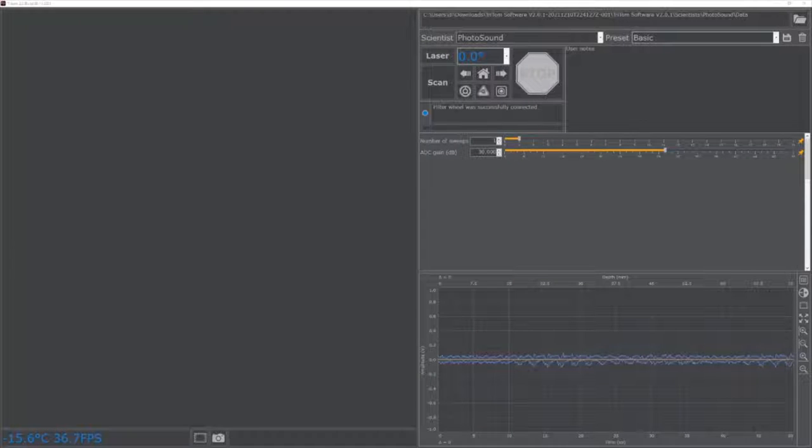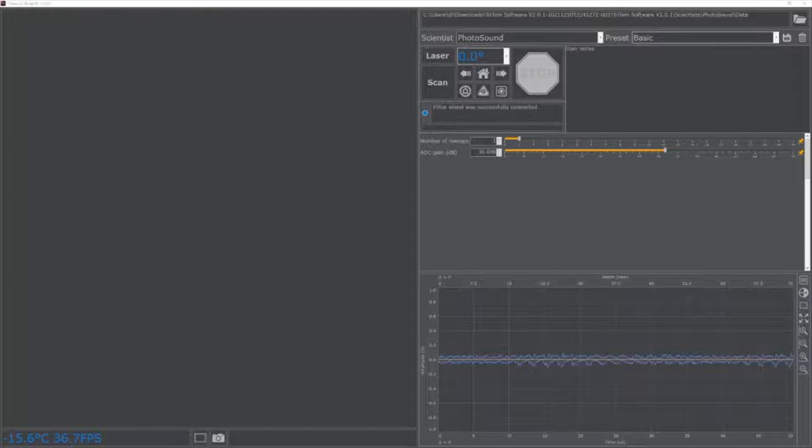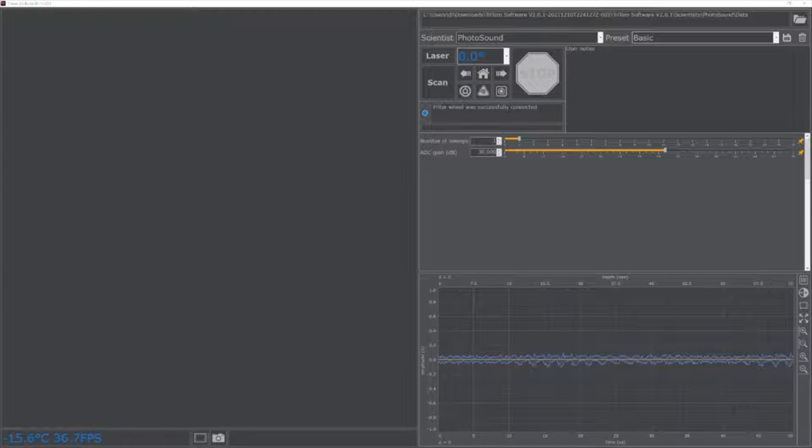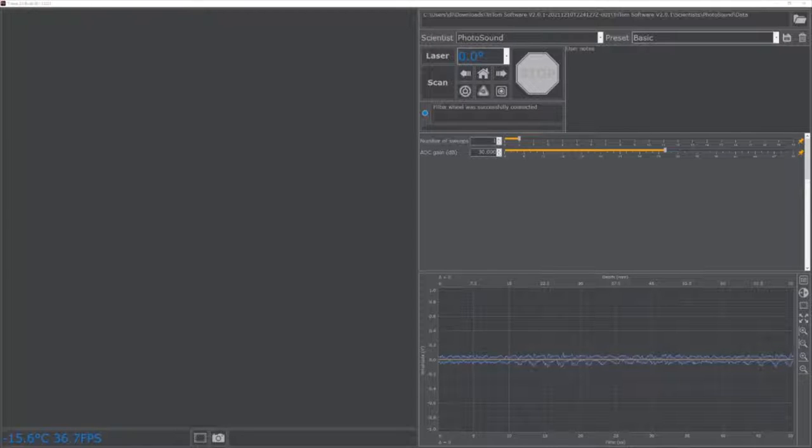The TriTom imaging software consists of five main components: the user profile menu, camera viewer, photoacoustic signal viewer, scan settings menu, and active settings menu.